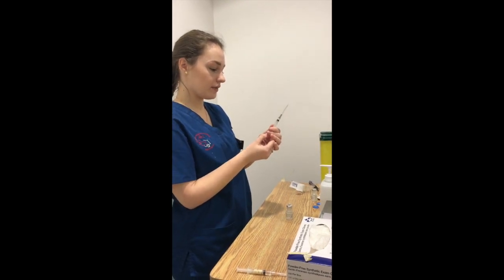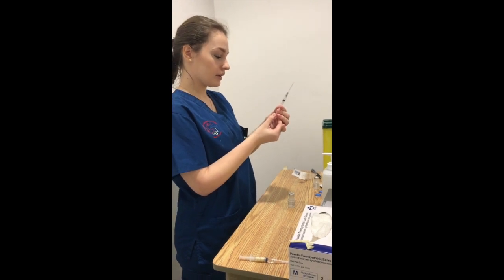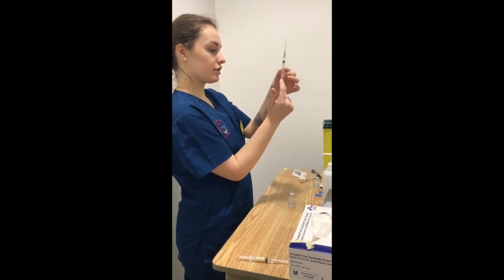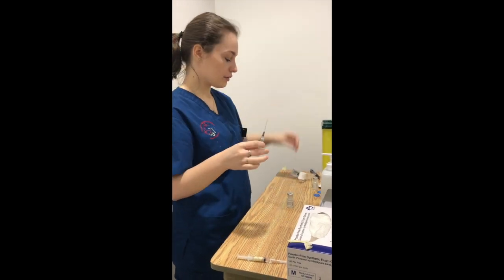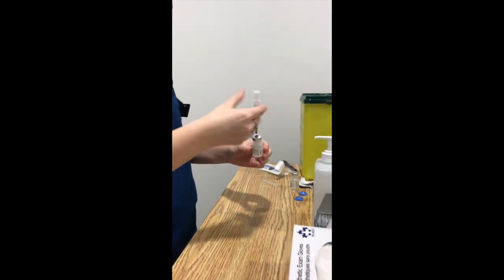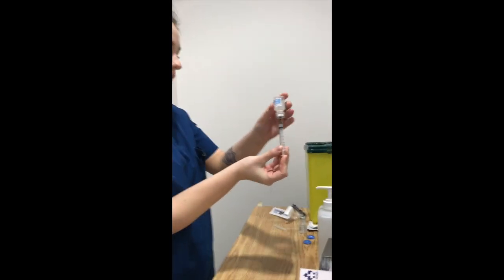So the injection we're giving Mr. Mancini is for 0.5 mL. So we're going to pull just past there, again making sure that we're not touching the inside of the plunger. We're going to remove the cap, and then we're going to stick the needle in there. We're going to push the air in, and then we're going to invert.